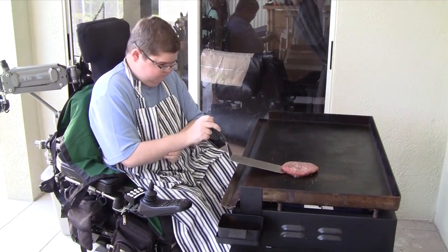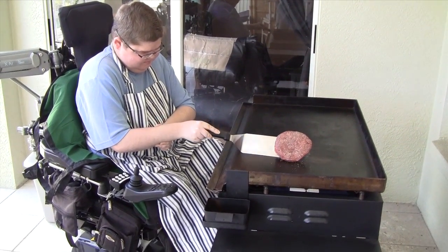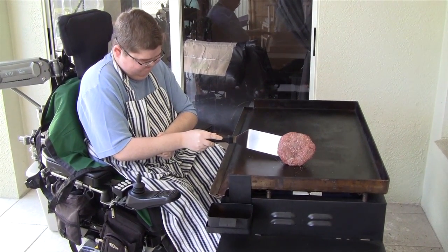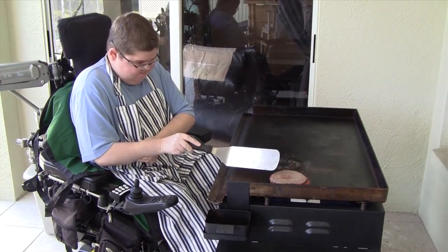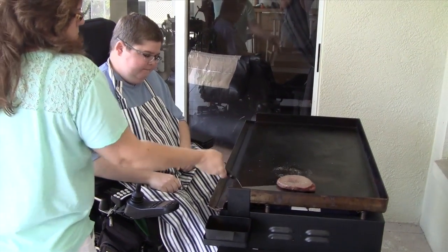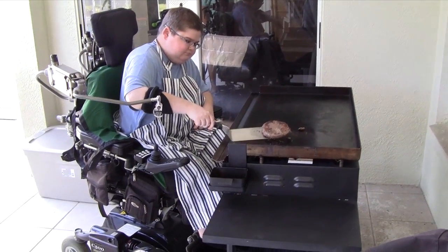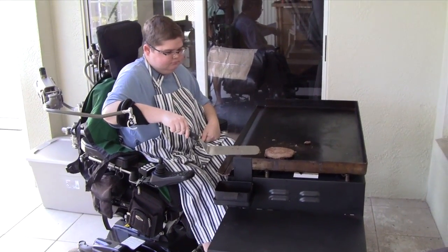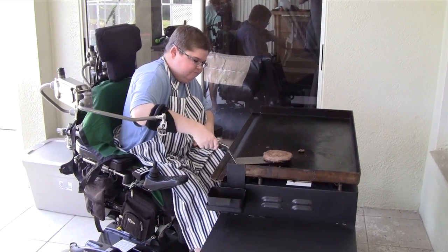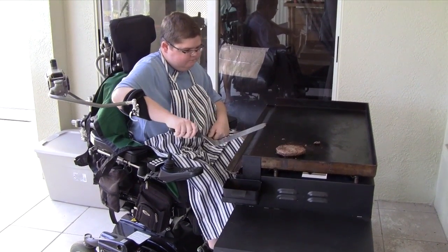Zach is using both hands to try to force the ability to flip the hamburger. He's able to get it over — took a little bit of doing. Much better — lift it up in the air. Wow, awesome!